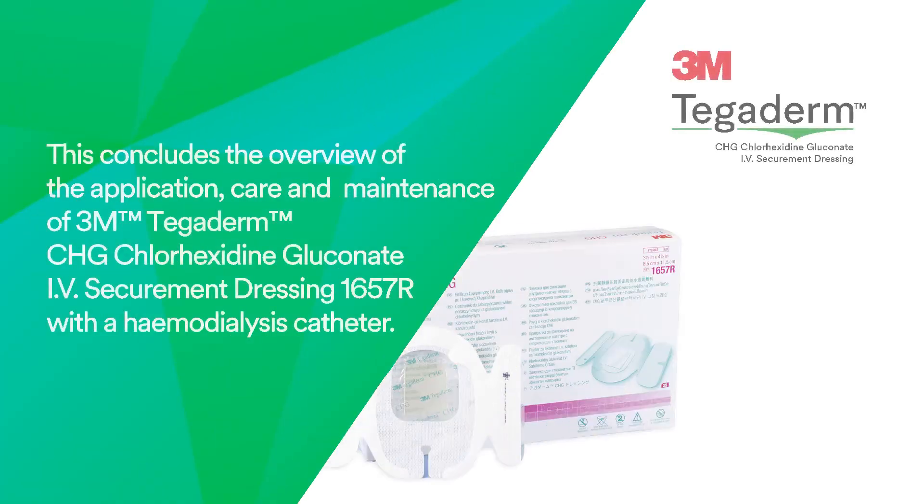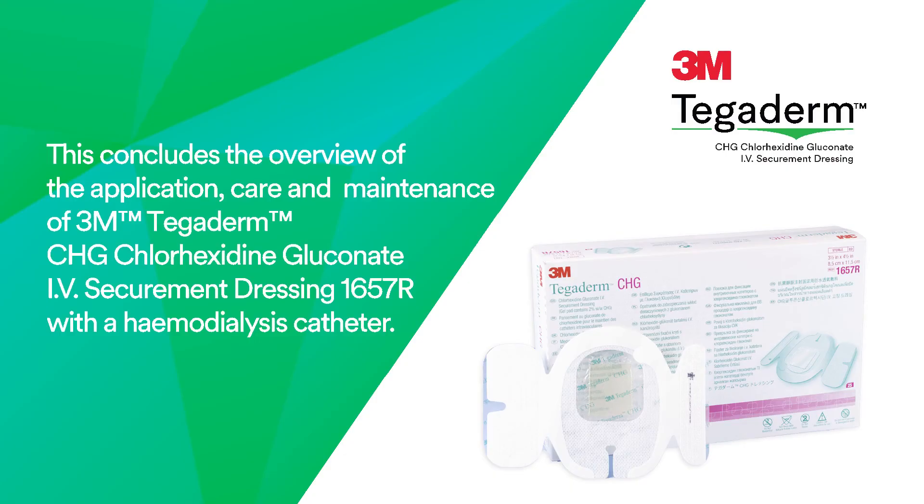This concludes the overview of the application, care and maintenance of 3M Tegaderm CHG Chlorhexidine Gluconate IV Securement Dressing 1657R with a hemodialysis catheter.